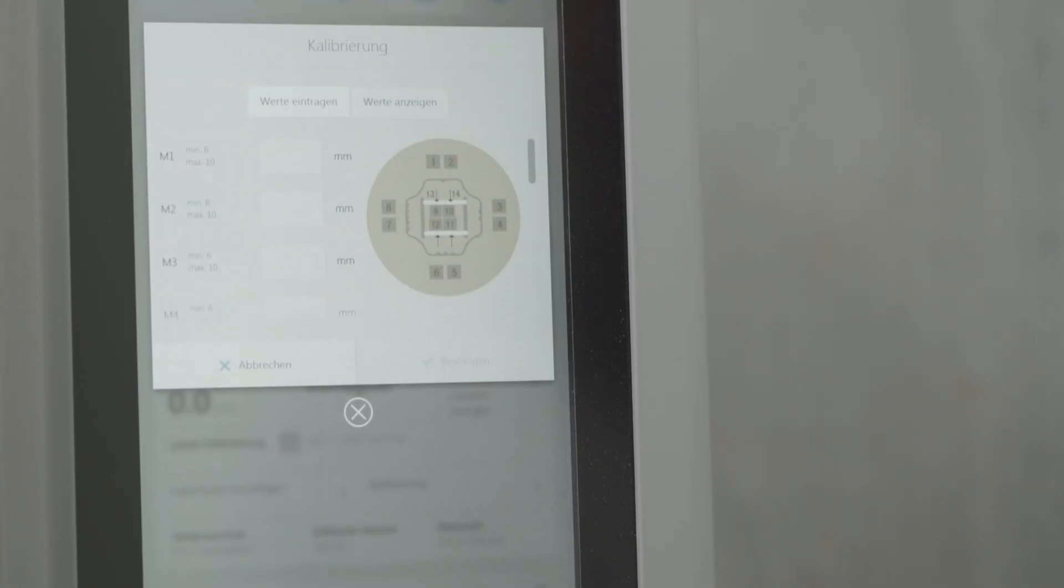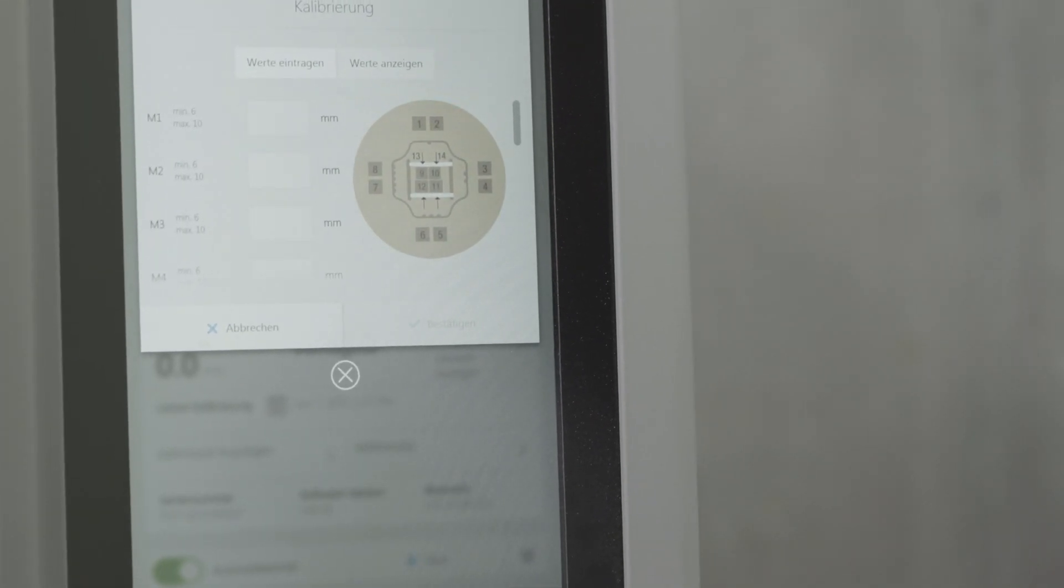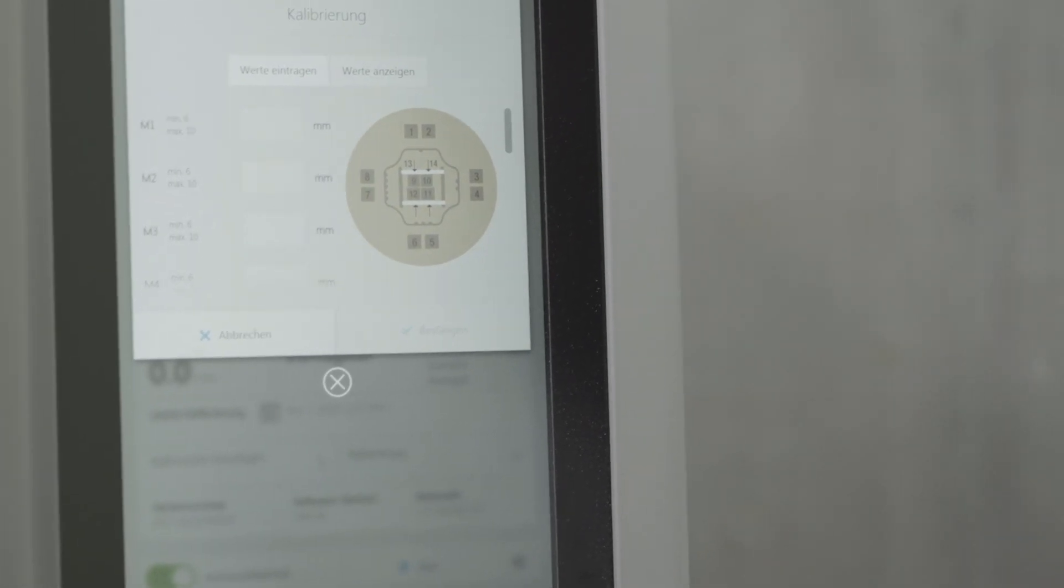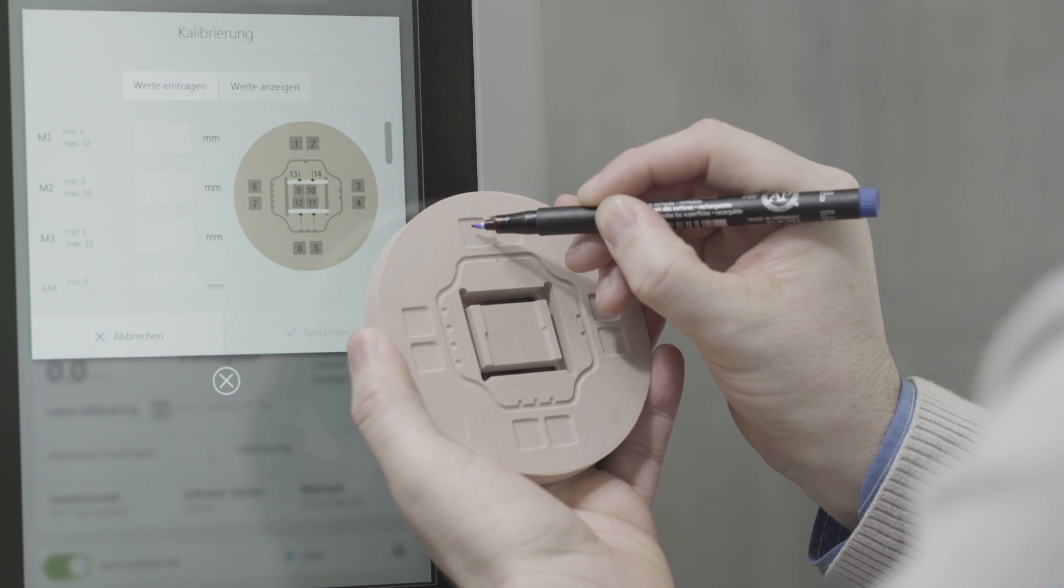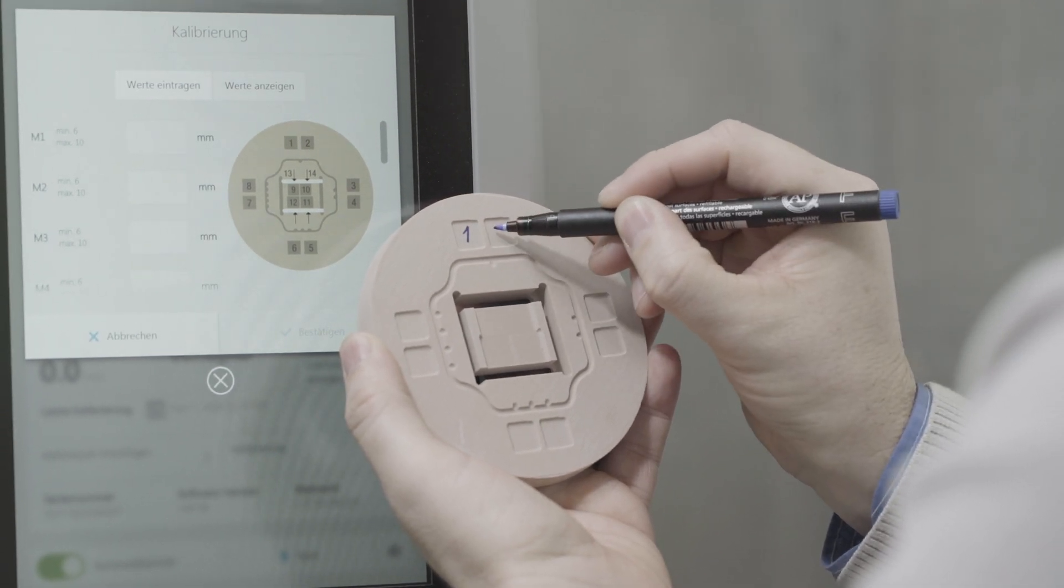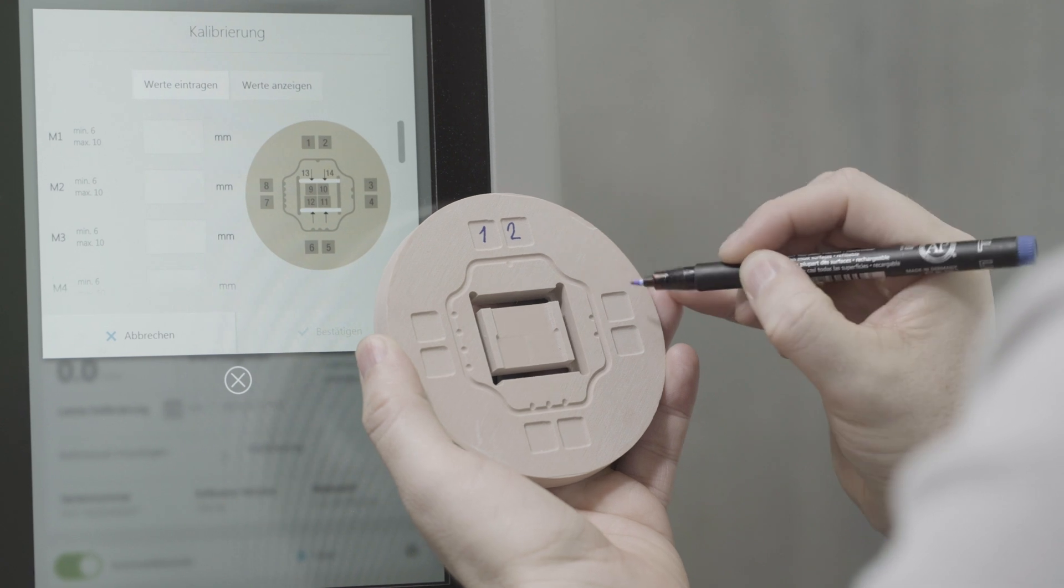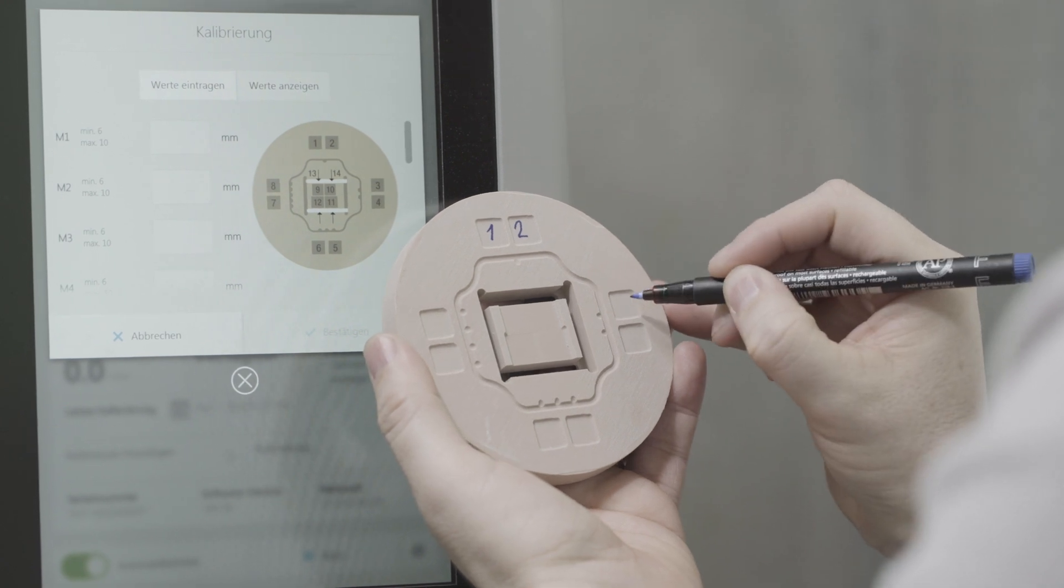Tap on Calibration in the tab Machine Information. To make it easier for you, you can mark the measuring points shown on the diagram on the test specimen blank.